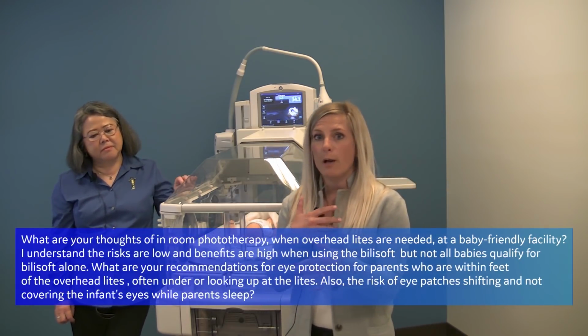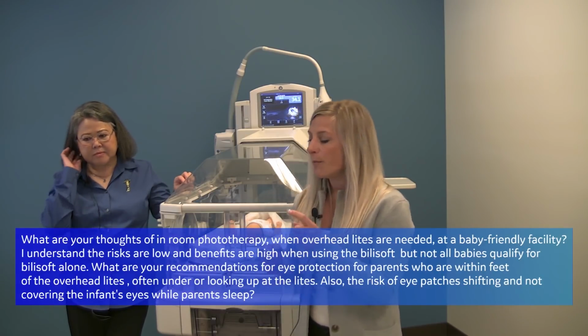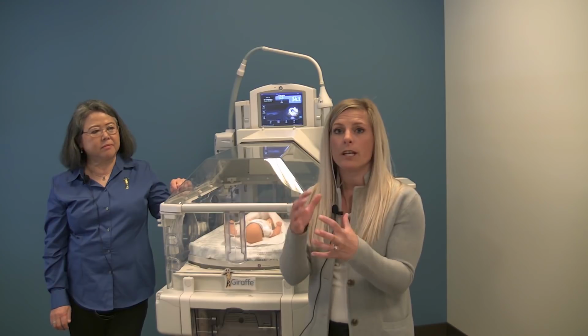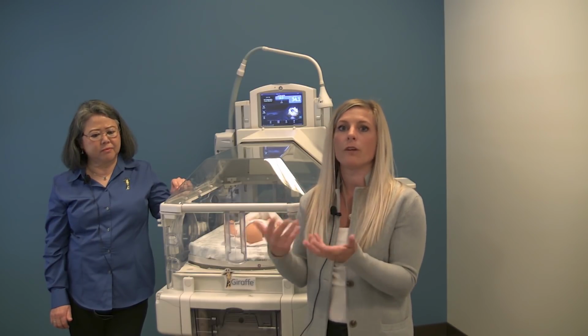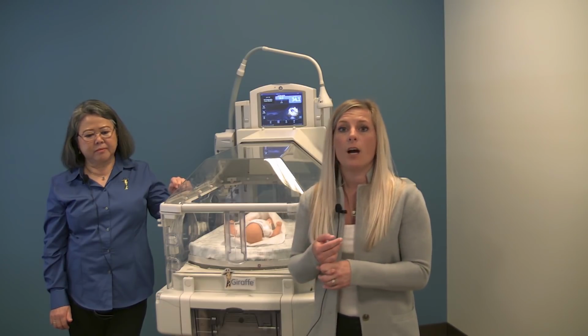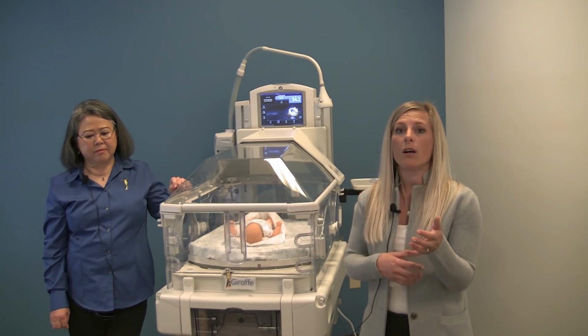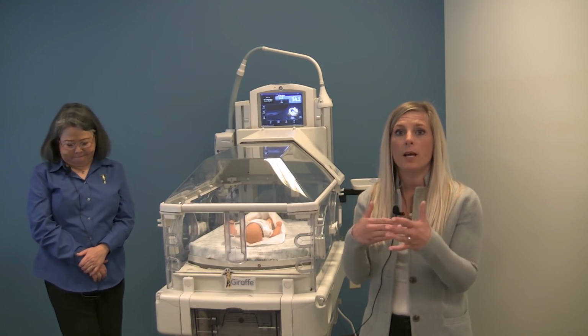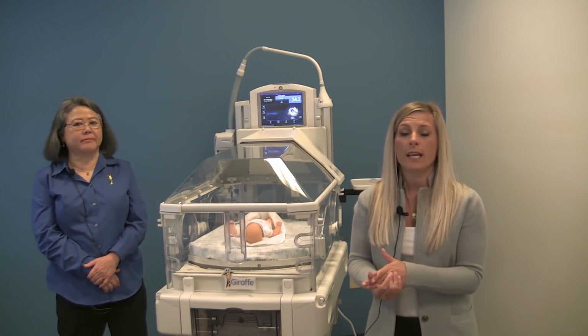So this goes back to that baby-friendly initiative. This particular viewer had written in that question, a multi-part question regarding in-room phototherapy. First of all, if we're using the overhead lights in the room and the parents or caregivers are complaining of that blue light irritating them or giving them headaches, absolutely they can cover their eyes.